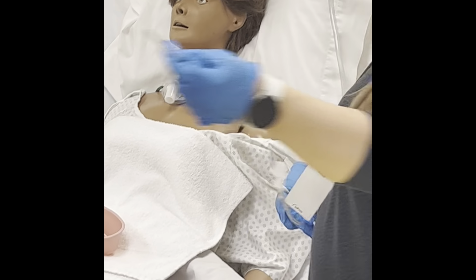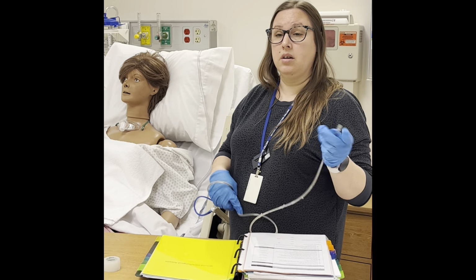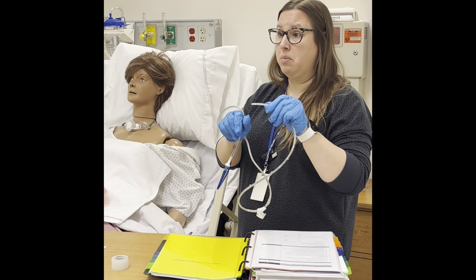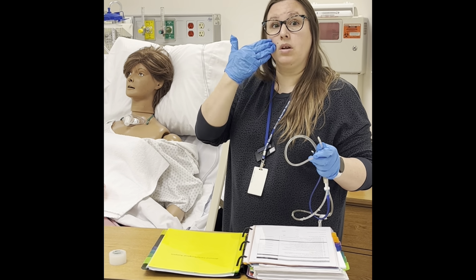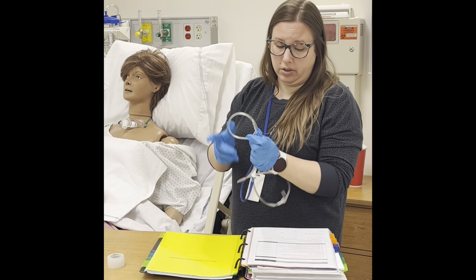So we wanna check to make sure the tip is intact. Again, remember this is stomach acid. It really could eat away the plastic. I've had some where they're hanging on by a thread when we've pulled them out. What if the tip is missing? Is it in the stomach? Is it in the esophagus? Back of the throat? Is it in the nose where they could then inhale it? That's why it's gonna be really important to look.